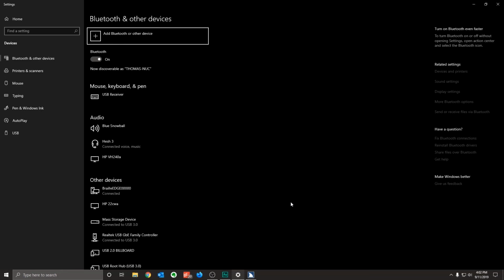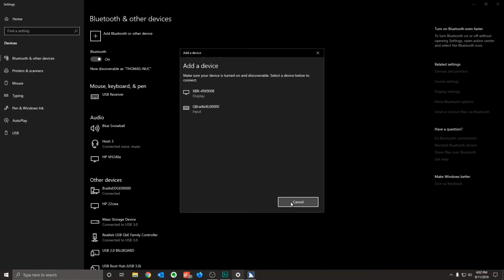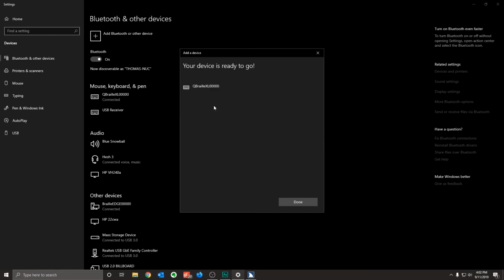I could use my mouse or I could just press Enter on the button. Add a device. Choose the kind of device you want to add. Bluetooth button. This opens the Add a Device dialog box, and I'll click on the Bluetooth option again. Add a device. Make sure your device is turned on and discoverable. Select the device below to connect. Cancel button. Now, a list of Bluetooth devices will populate. This time, I want to click on QBraille, so I'll do that now with my mouse. QBraille XL 00000. List box. QBraille XL 00000. Done button.